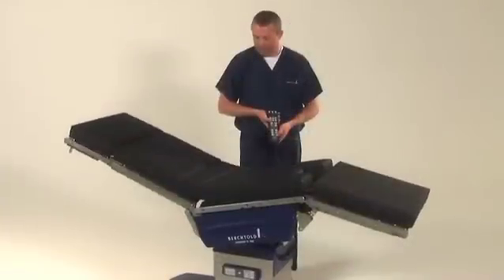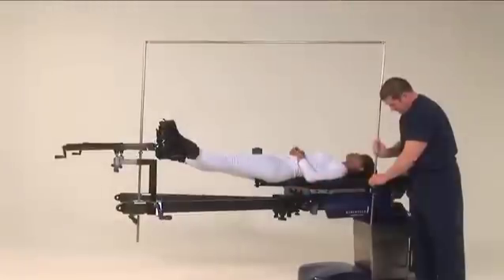In addition to the table's full range of articulation, Operon includes a full line of compatible accessories to meet every surgical requirement.